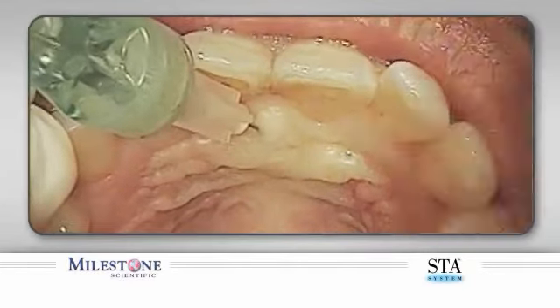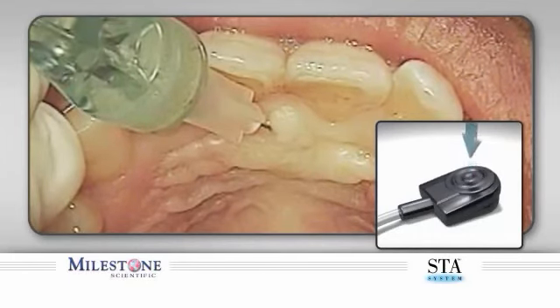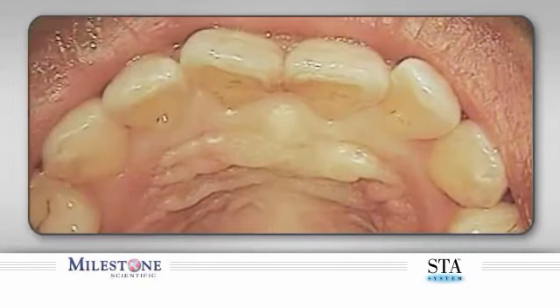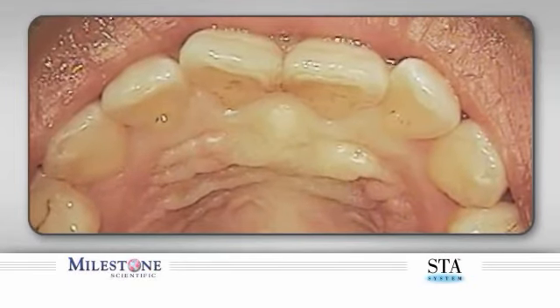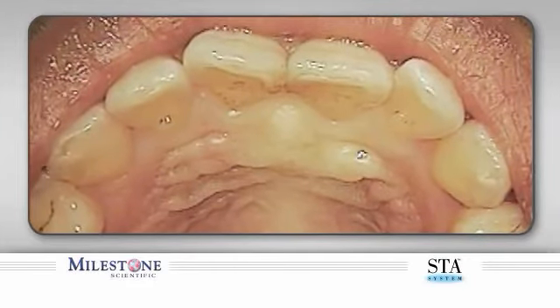While the needle is still embedded in the patient's tissue, depress and release the foot control pedal. Count 3 beeps after releasing the foot control pedal, and then totally remove the needle from within the patient's mouth. Direct the needle away from the patient, as a small amount of anesthetic solution may still be present.